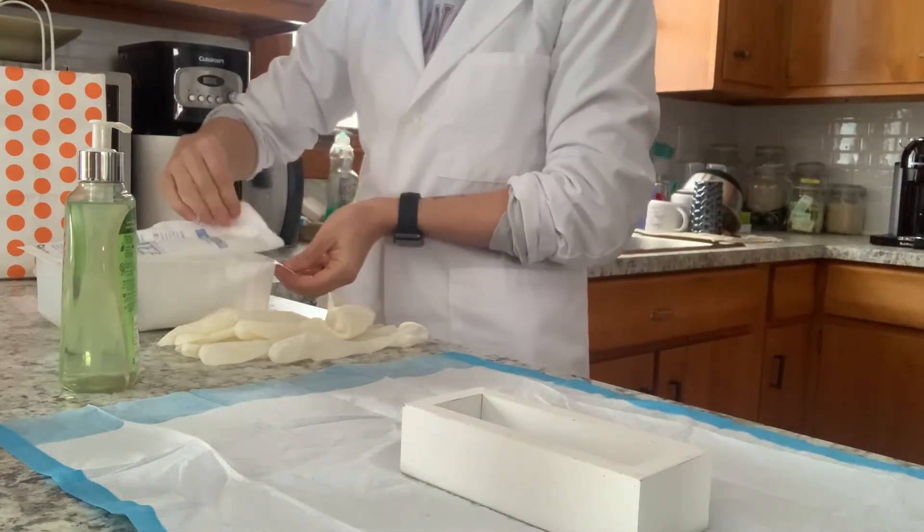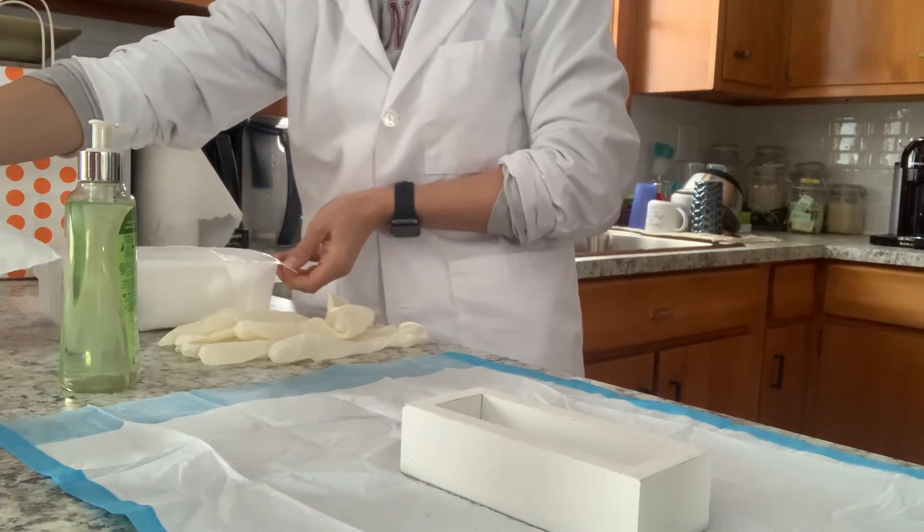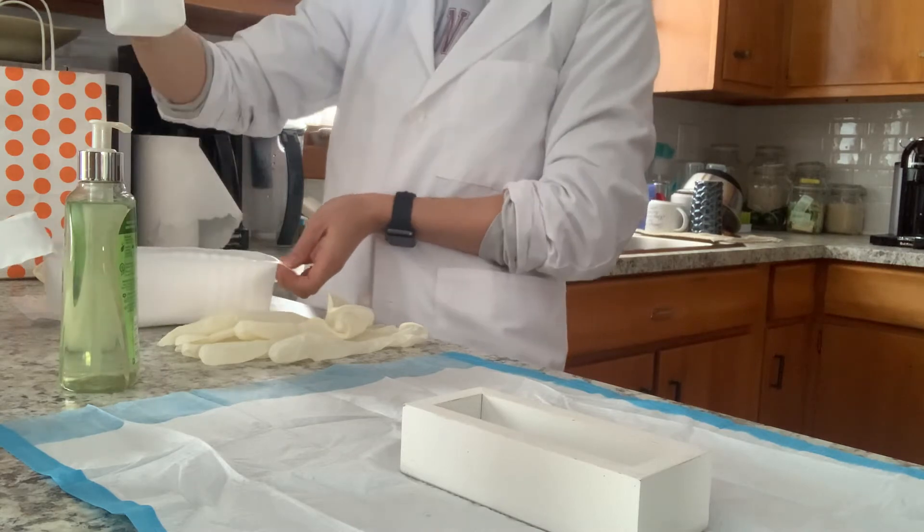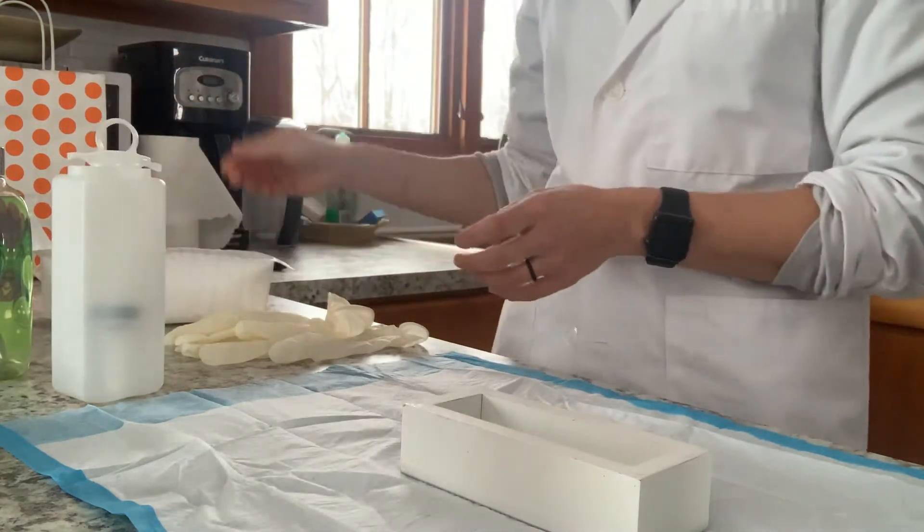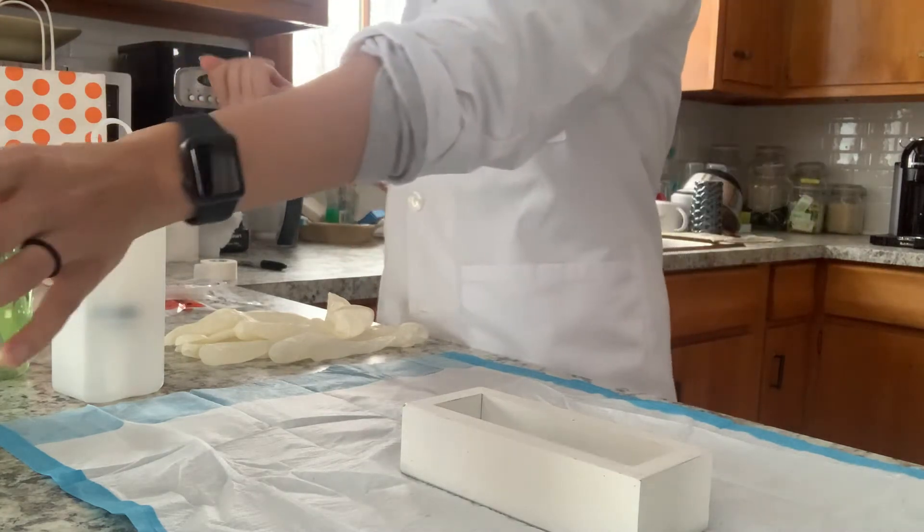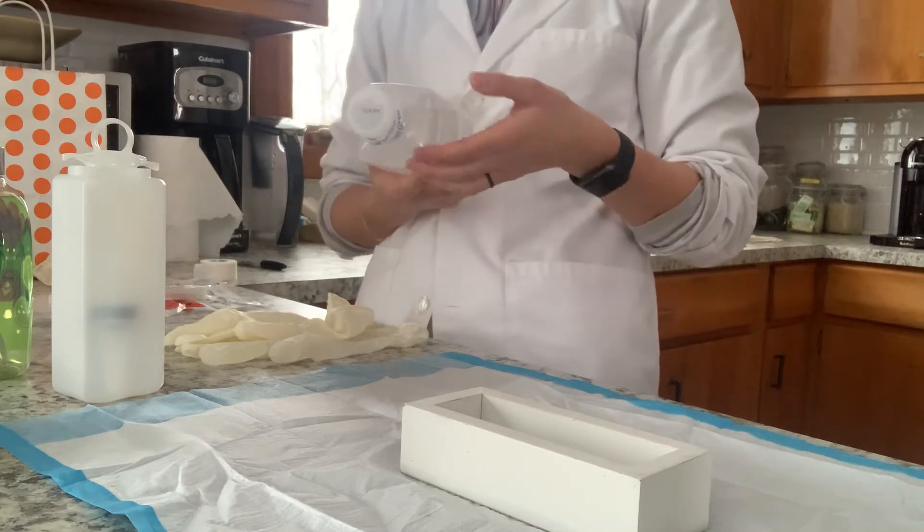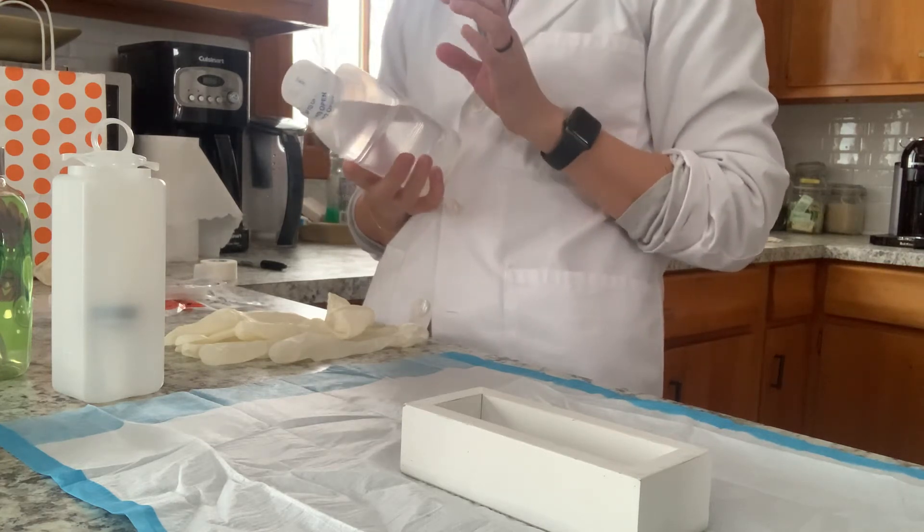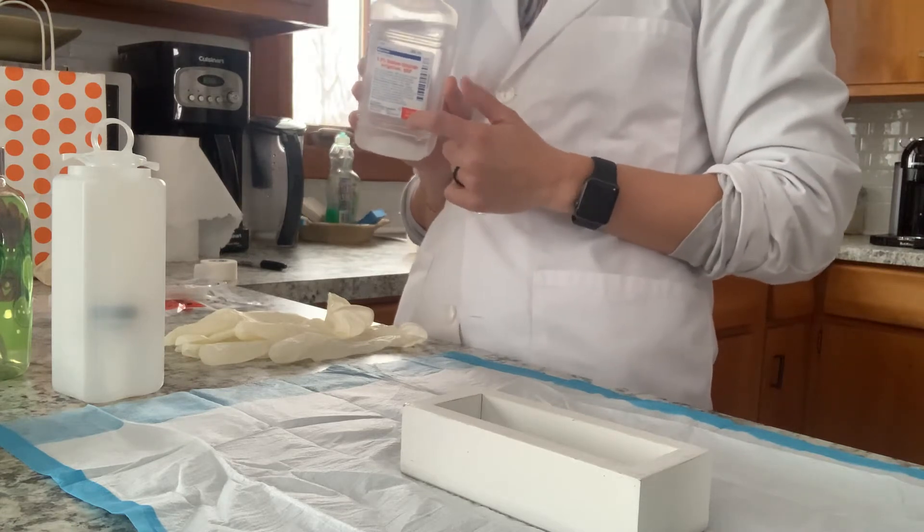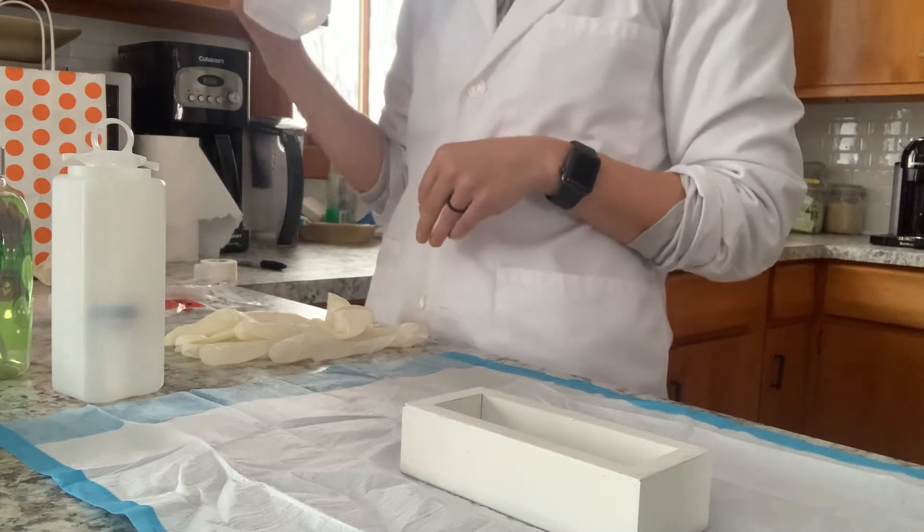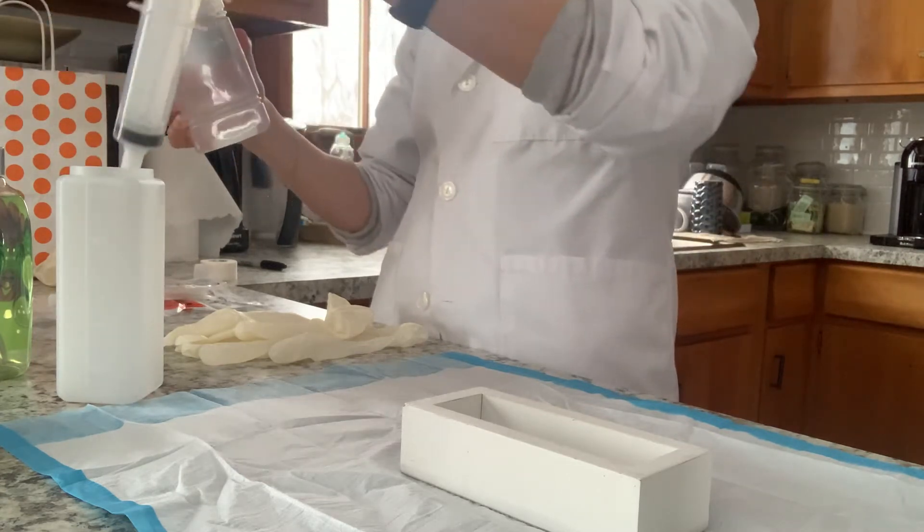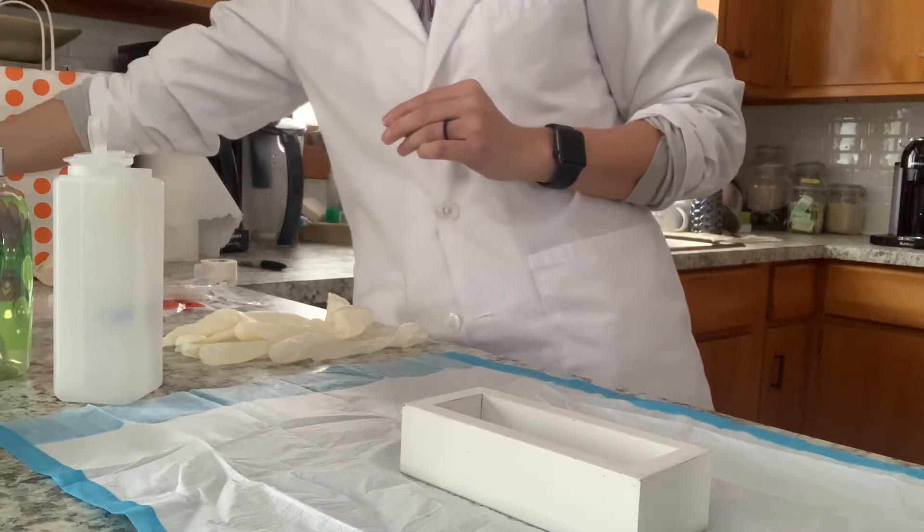So because this is sterile on the inside, I am going to carefully open and pull back, make sure to not reach over. I am then carefully going to pull out the syringe and I would have a garbage right next to me to throw away. I am then going to make sure that my normal saline, if it has been opened, I am going to check the date that it was opened and make sure that according to the hospital policy, it is still okay to use. If it's a brand new bottle, I am going to check the expiration date to make sure that it is also okay to use. So then what I would do is I would open this up. I'm going to fill this with sterile saline and then I'll move this over here until I need it again.